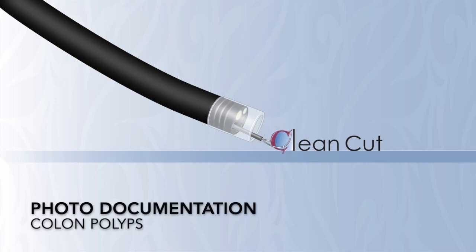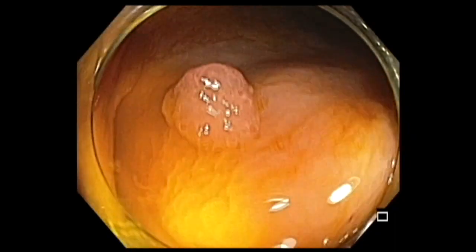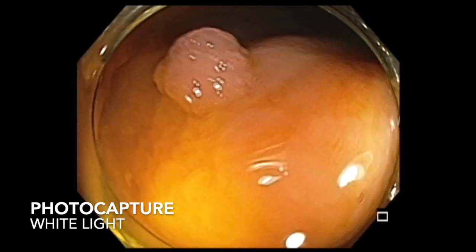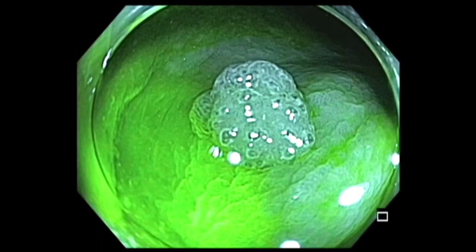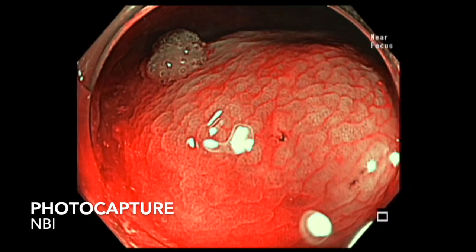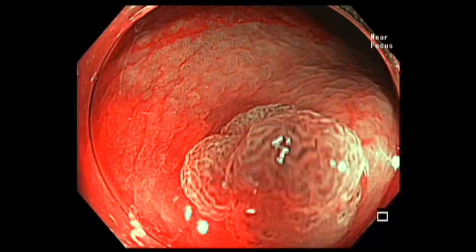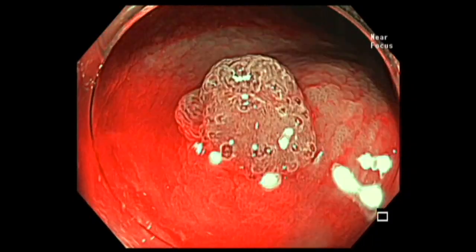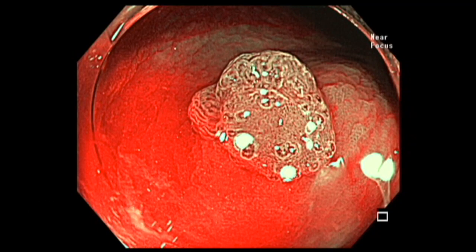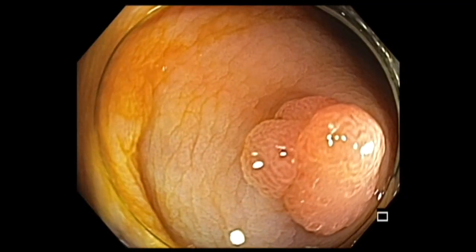Let me share with you how to photo document a colon polyp. Every time I see a colon polyp, I capture it under white light and then under NBI. And if you have a scope with a near focus function, it's a good idea to capture that under near focus and also document the outcome of resection.